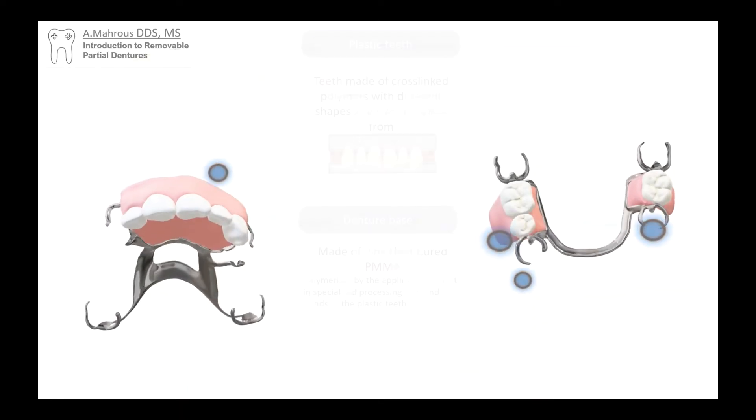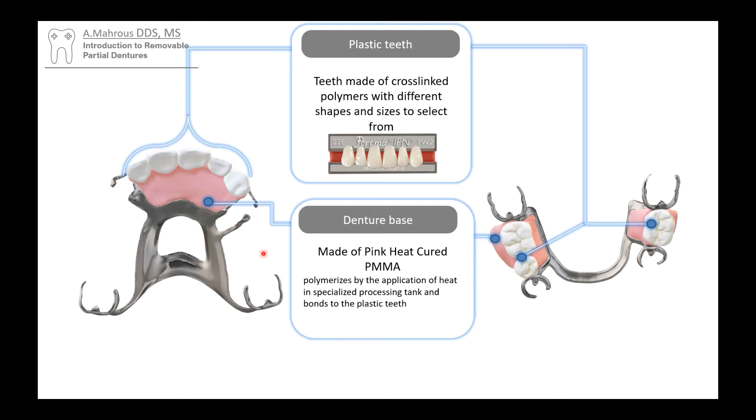Looking at the partial denture itself, you'll see that it's got these artificial teeth. These teeth are made out of cross-linked polymers — a very tough plastic — and they are bonded to another type of plastic that is pink. That one is PMMA. You might know PMMA for making temporary crowns. It is the same material, but instead of curing with the factor of time, this is heat-cured PMMA, which means it needs external heat to cure. You can see that the heat-cured PMMA, which is pink in color, is attached to the cross-linked teeth. They're both plastic, so they bond to each other.